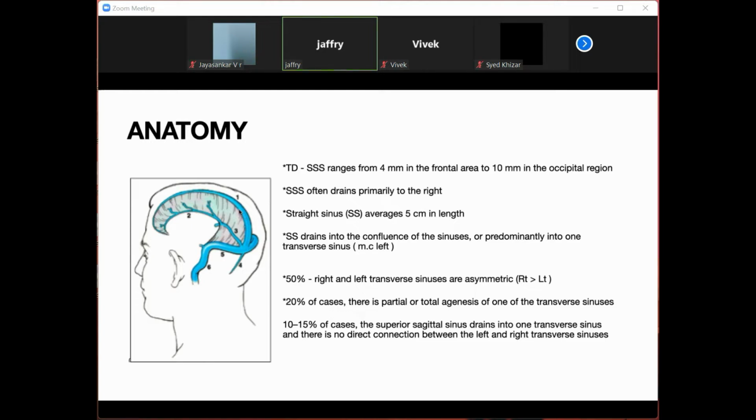The clot, when we see it in the images, is more in the posterior part of the superior sagittal sinus, where technically, while injecting the thrombolytic agent for the endovascular procedures, it is important to understand the amount of clot so that we can decide about the dissolving agent, the quantity and volume of the dissolving agent.